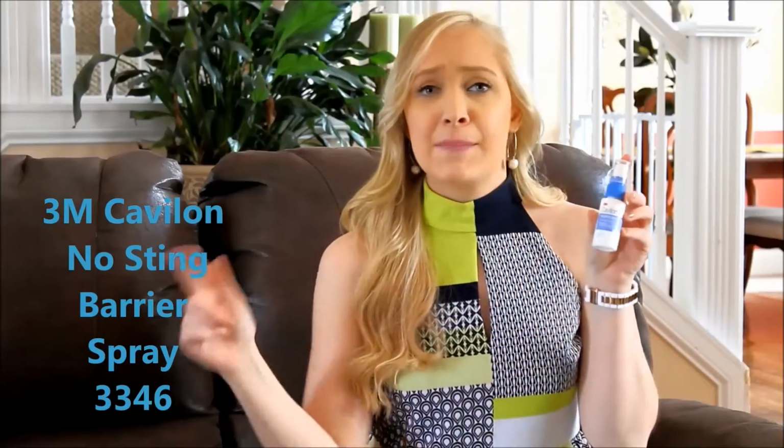So the first thing I do when everything is clean and dry and I'm ready to put it on, I start by spraying this Cavilon No Sting Barrier Spray. I'm going to link everything down below in the video description, so you'll be able to find the link of where I get my sprays and stuff. So don't be sparing with this.